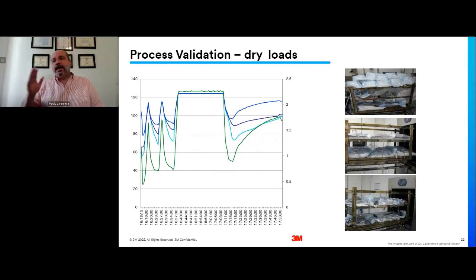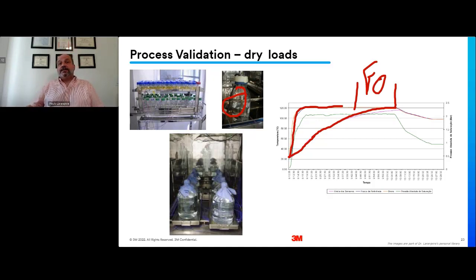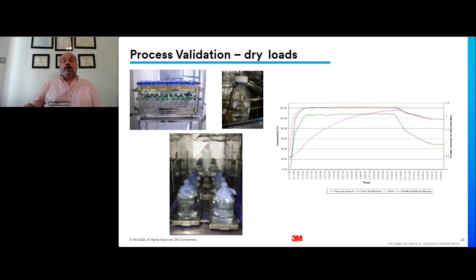And then for the last part of the cycle, for the dry phase, the only thing that we have is that at the end, all the loads have to be dry. I cannot have water inside of my package. For liquids, like I mentioned, this is just to show you the sensor inside of the load. So even though the drain reaches the sterilization temperature, the temperature of the liquid takes a while to heat up, right? And then what they use is the calculation of F0, or lethality, because sometimes they never reach the temperature. So that's how they do it for liquid sterilization in the industry.